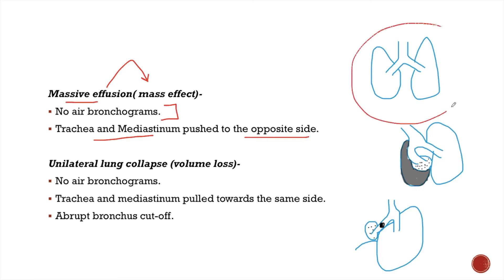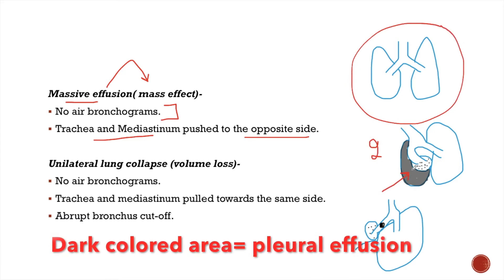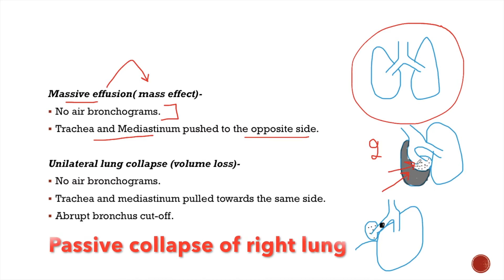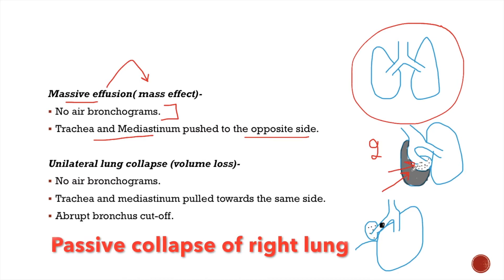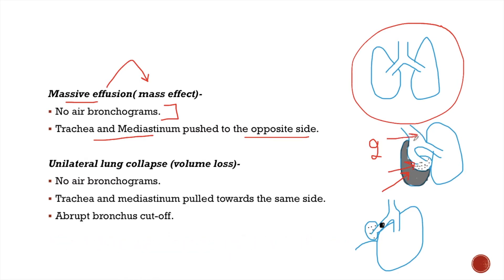This is the normal lung, and in the second image we can see that there is effusion on the right side. This effusion has caused mass effect with passive collapse of the right lung. It is causing deviation of the trachea towards the left side, and the mediastinum is also shifted towards the left side.